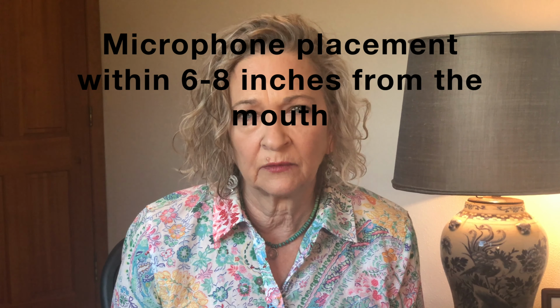In any bricks and mortar classroom, an RMHA is only as effective as the person using it is conscientious. If the microphone is not placed correctly within 6 to 8 inches from the mouth, then much of the acoustic information is lost. And although it is a wonderful tool, it does not negate the need for the other accommodations that your child might benefit from.